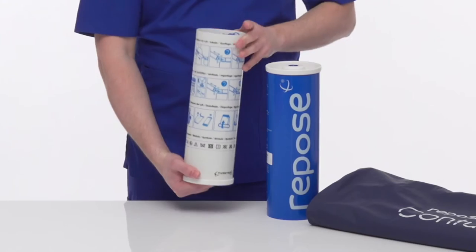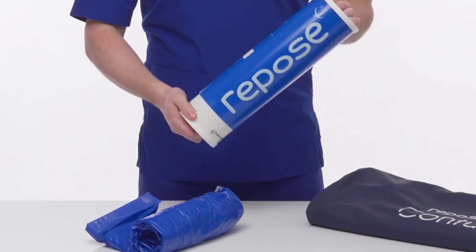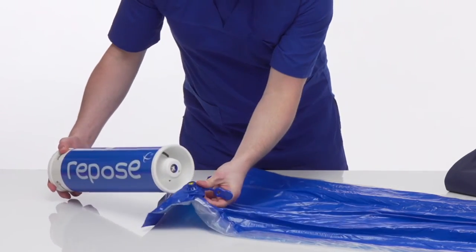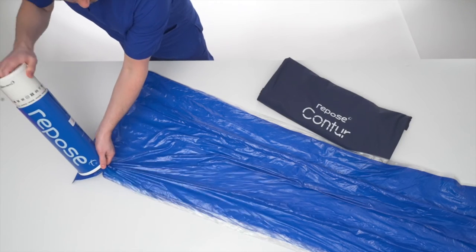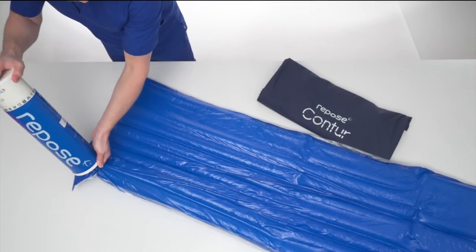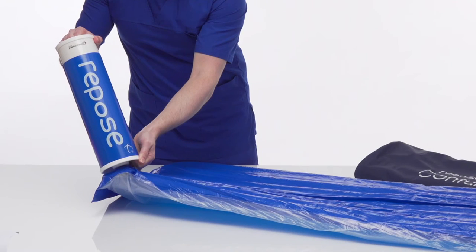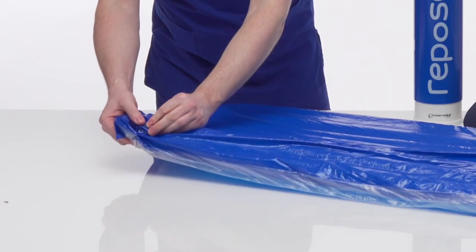Remove Repose from the tube and refit to form a pump. Connect the valve on the pump to the Repose valve and push to fit. Begin inflating and continue until air can be heard escaping from the pump valve. Discontinue inflating and wait to hear an audible click — this signals correct inflation pressure has been achieved. Disconnect the pump and cover the valve with the solid end of the Repose sealing cap.